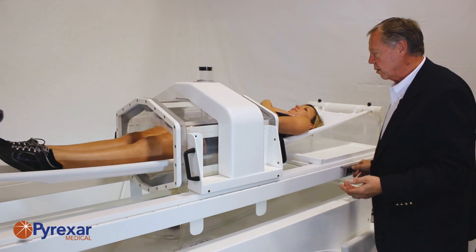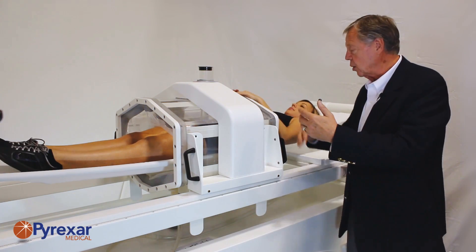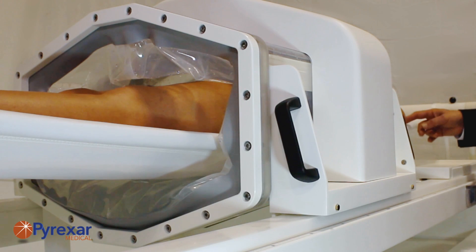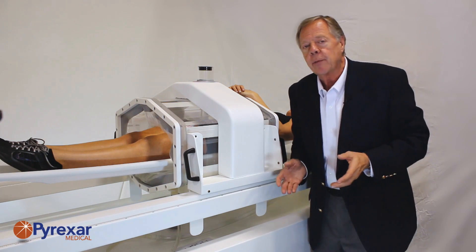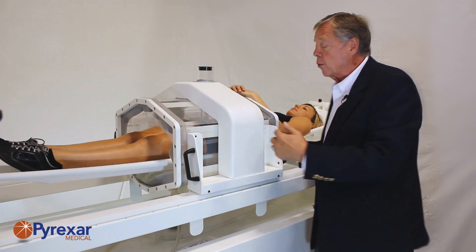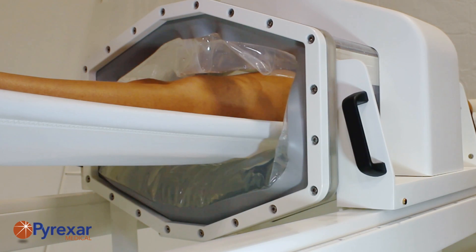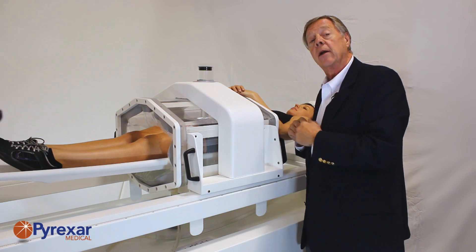When the patient is positioned and centered, we activate a mechanism to fill a water bolus around the patient. The water fills a silicone membrane — a cylindrical cuff around the patient — so that water surrounds the patient completely in all areas between the antenna array and the patient's body. This uniquely provides a high dielectric path, or conduit — sometimes called a dielectric waveguide — which allows the energy to flow selectively into the water area and into the patient's body without stray fields being radiated outside into the air. This is accomplished primarily because the antenna length is such that it is not an effective radiator into open air.